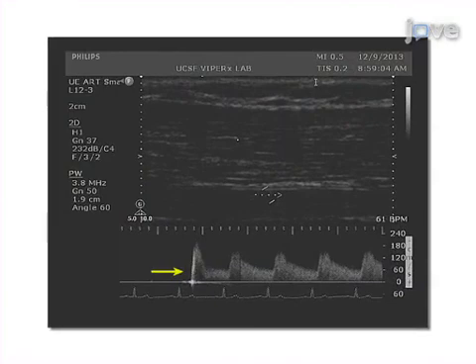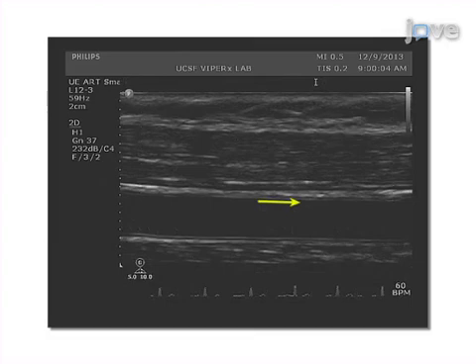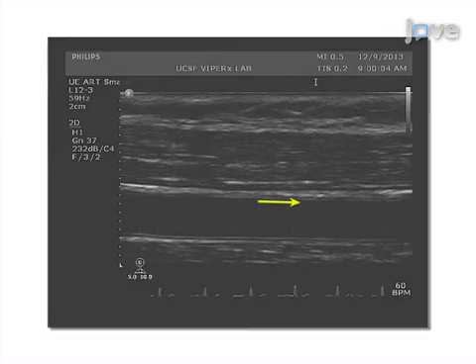Ultrasound assessment of endothelium-dependent flow-mediated vasodilation of the brachial artery is used to show the percent increase in intima-media diameter. This method can help answer key questions in the field of cardiovascular surgery, such as the effects of an intervention or risk stratification of a study population.